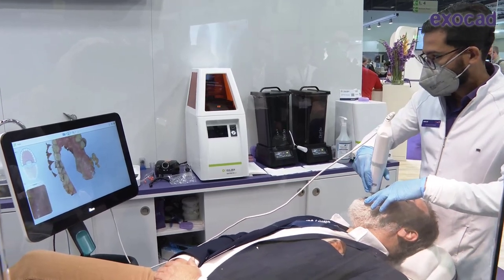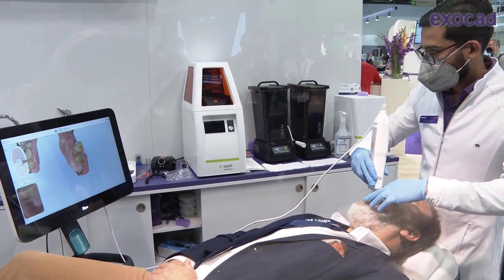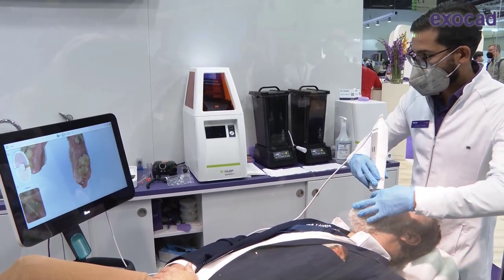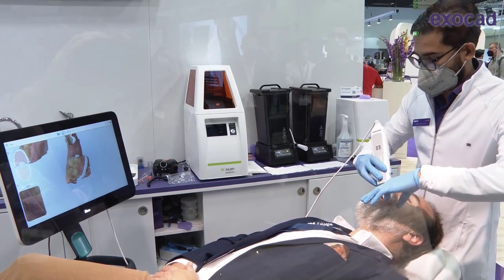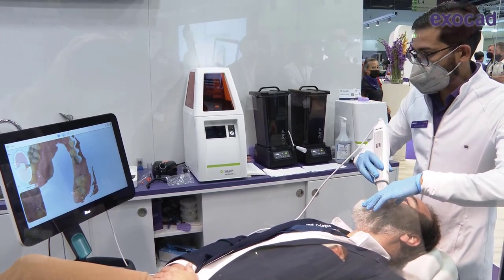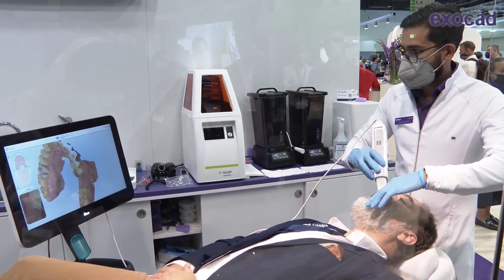If there's anything missing, you can always fix it up later — there's no pressure with scanning. With a bit of routine, you can scan a full arch lower, upper, and bite scan in under a minute. If you want to do it more calmly, a minute and a half or two is also absolutely fine — it depends on the patient.